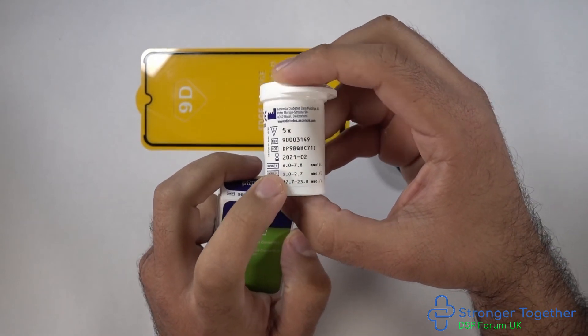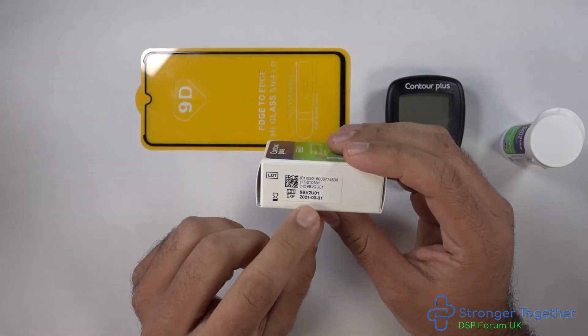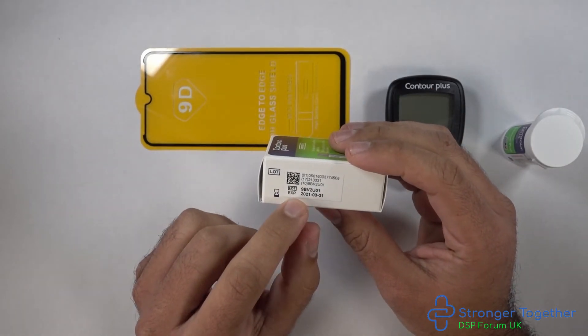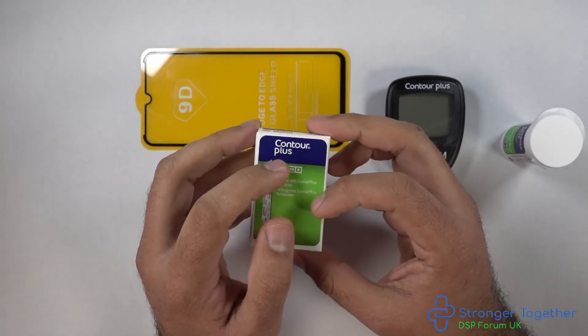Here we have our control solution — check the expiry date and ensure it is for the Contour Plus machine. Inside there is a detailed instruction leaflet which we're not going to cover today, so I would actually advise everybody to read that also.